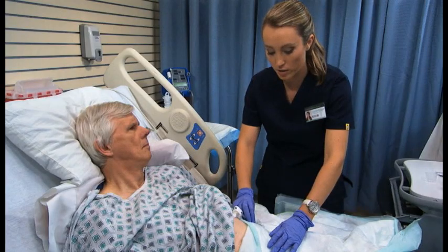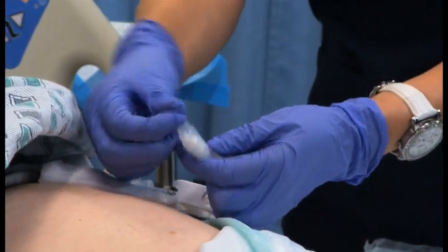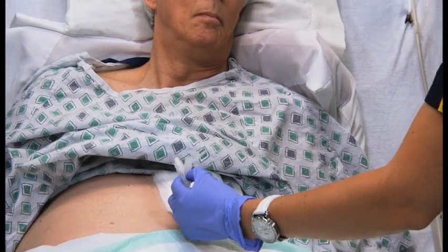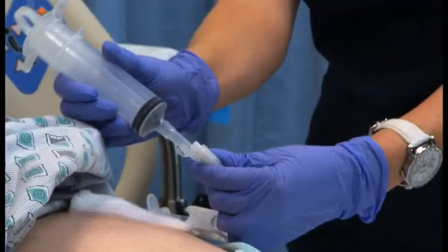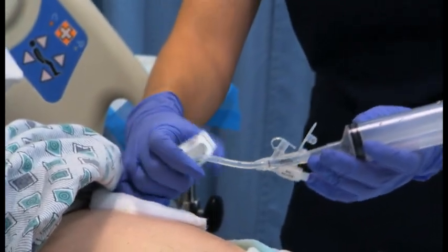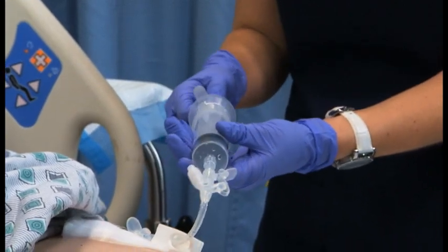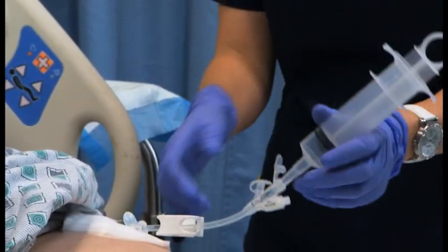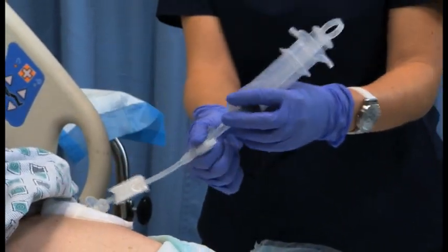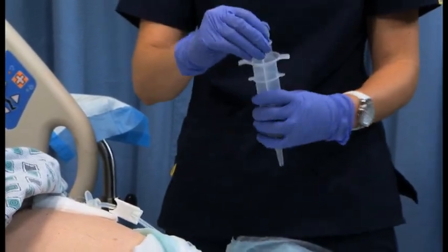So first I'm going to check tube placement. Because the tube is already clamped, I'll remove the end cap and attach the syringe to the port for medication administration. And unclamp the tube. Attempt to aspirate and note the amount of any residual. There is no residual. Now I apply the clamp to the feeding tube again and remove the syringe. Good. Then what? Remove the plunger of the syringe.